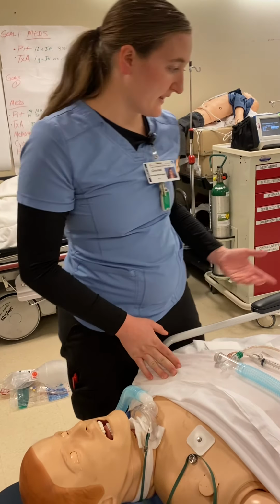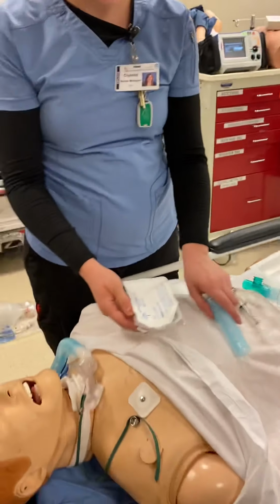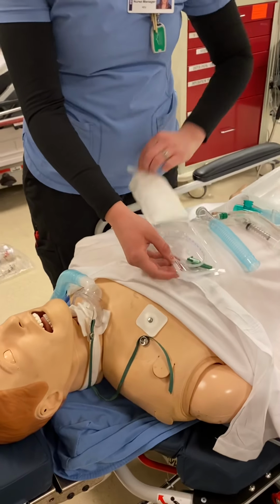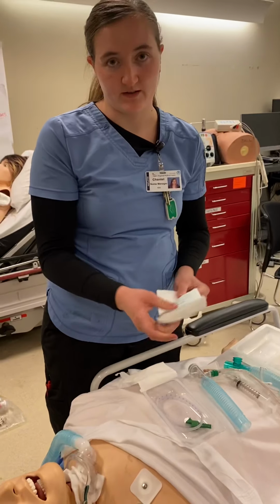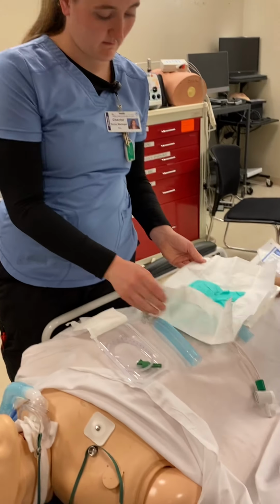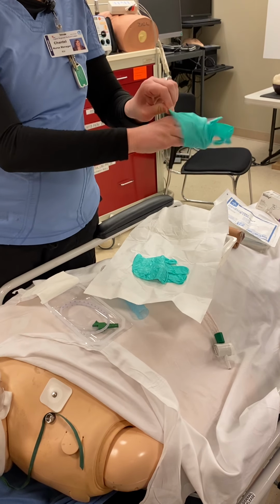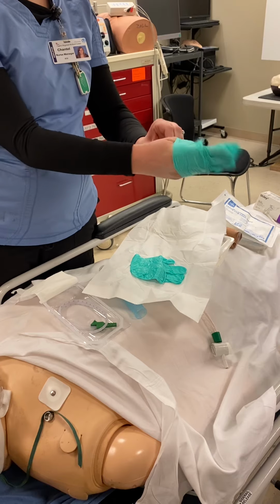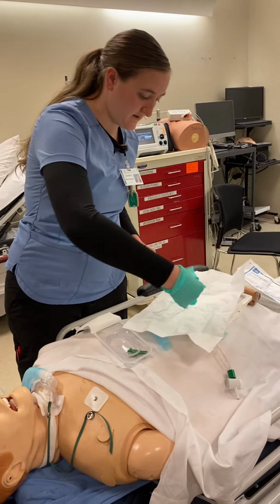If you wanted to inline suction, let's say we didn't have, or we have an inline suction, but if we wanted to just sterilely suction, this is when we are going to get sterile gloves. You're going to put your sterile gloves on, and they come together in the kit. Okay. Remember from nursing school how to put sterile gloves on?